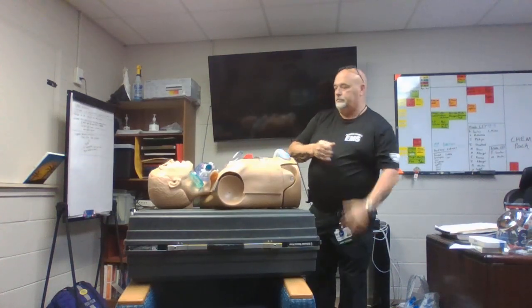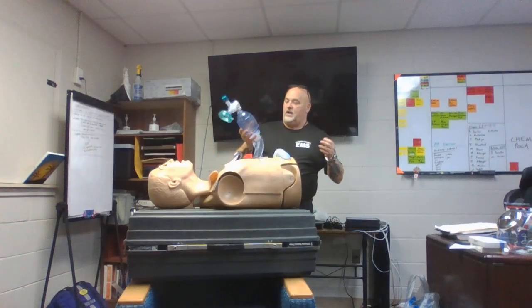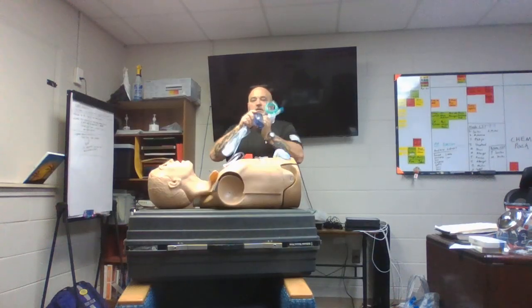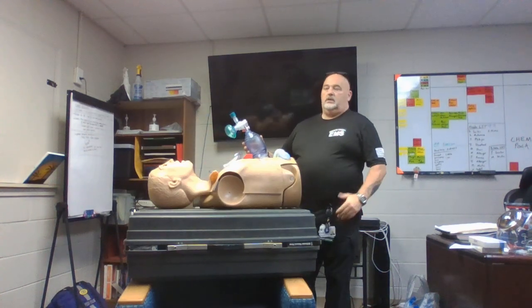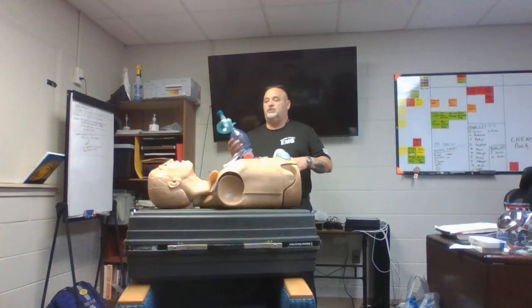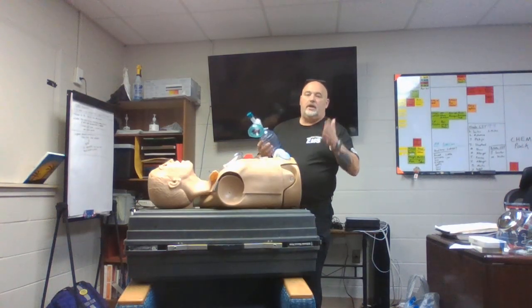Remember, do no harm. Everybody's favorite thing in the whole wide world, a bag valve mask. How many times have you got on a call and your first responders are going to town? I mean, they're crushing it, right? No rhyme, no reason, because adrenaline's up. They're all excited, you know. So we need to be that voice of reason. Good deep breath, slow down. You just want to get the chest to rise and fall. You squeeze easy. No barotrauma.